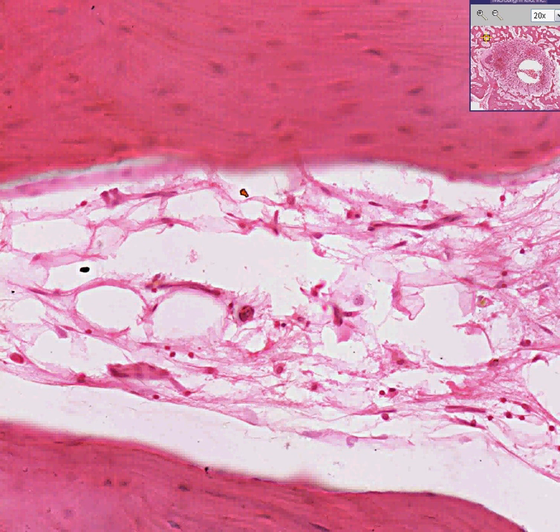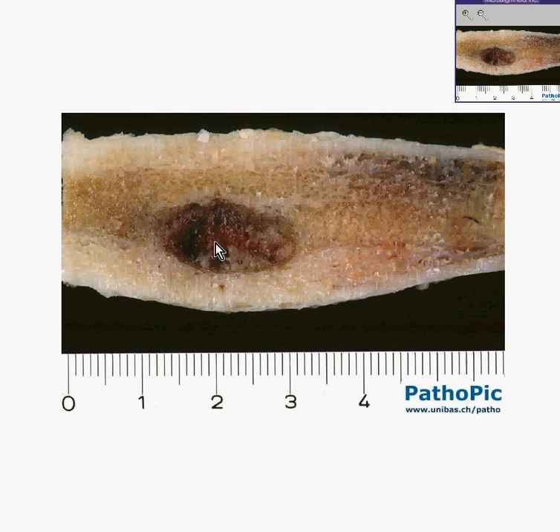Here is another picture of osteoid osteoma, in which you could see — probably nothing, because the computer doesn't want to show it. But if you look up here, you can see a little nidus there too.